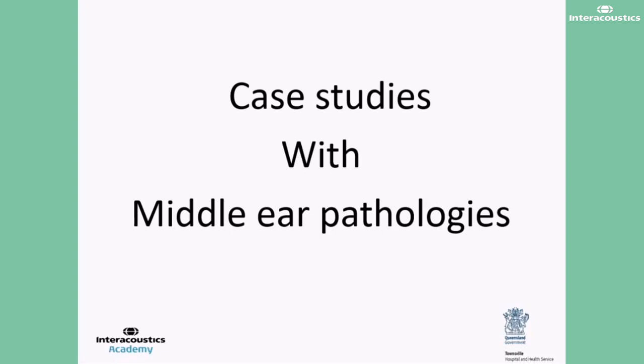Moreover, the patterns do change with the progression of the disease, and there's a significant overlap between normal patterns and middle ear pathologies. So it's important to note that wideband absorbance measures are not standalone measures. They should be interpreted along with other audiological measures to improve the identification of middle ear pathologies or even differentiate between possible middle ear pathologies.